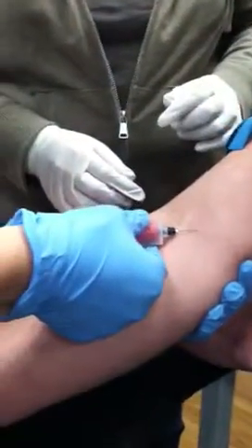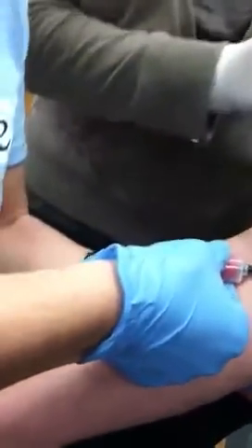How much do you want? It doesn't matter — I'm a vampire vial. You're done? Is that good to pull it out? No, pull this out first. Wait a second, let me grab a cotton ball.